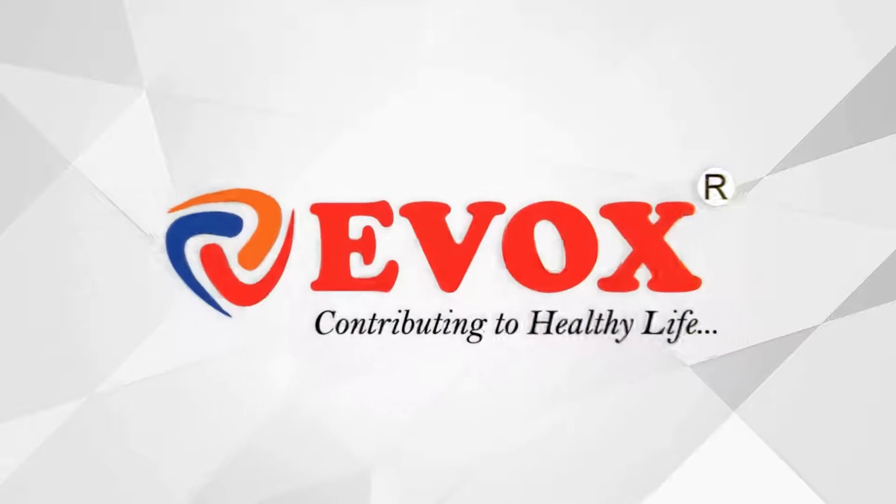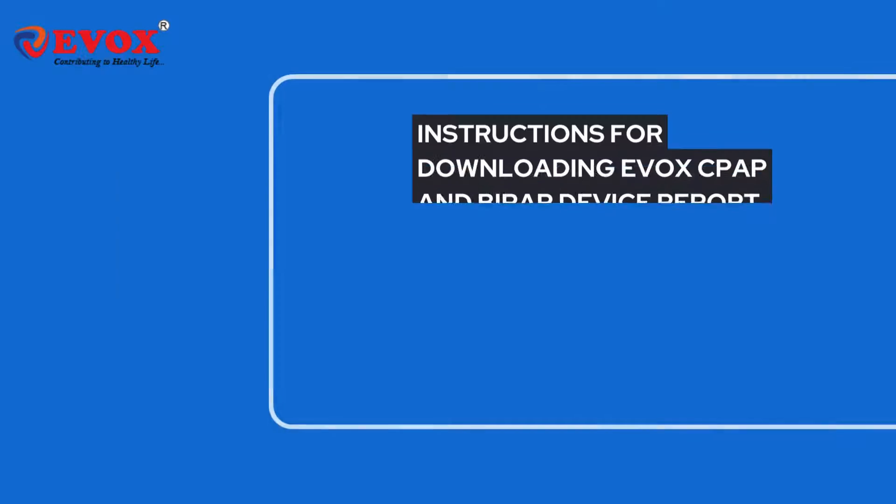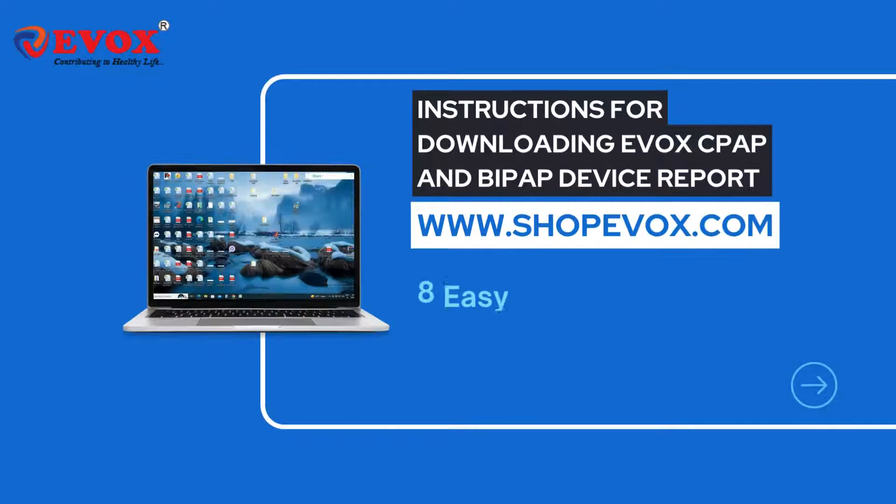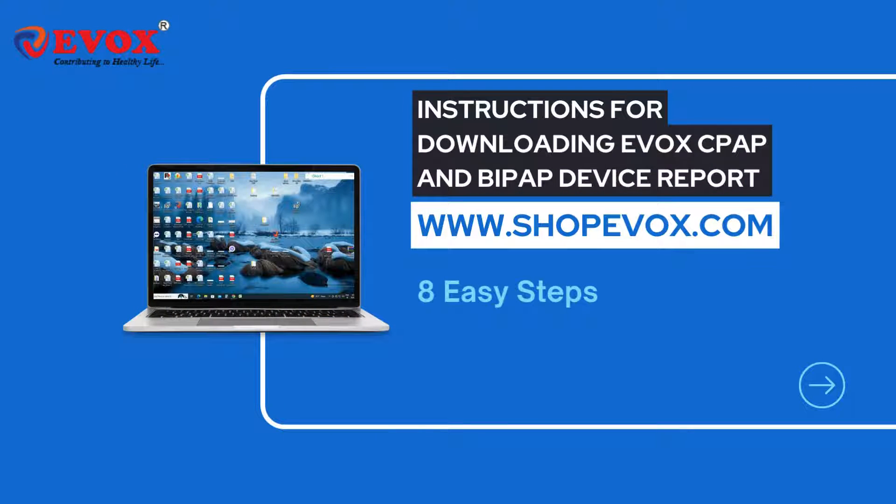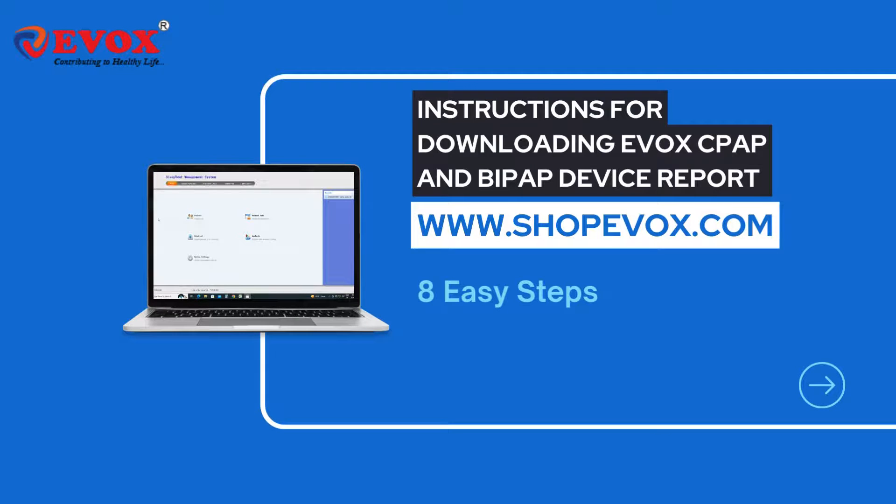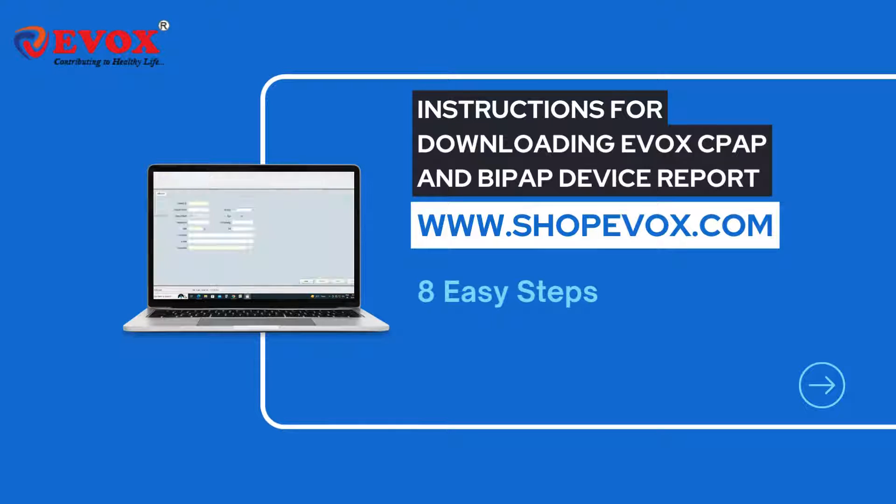Today, we will guide you through the process of downloading the report for Evox CPAP and BiPAP devices. Visit our company website, shopevox.com, where you can find an online link for the software download and a QR scan code.